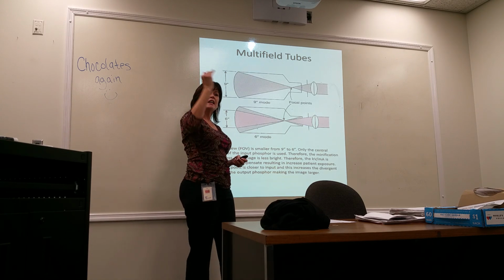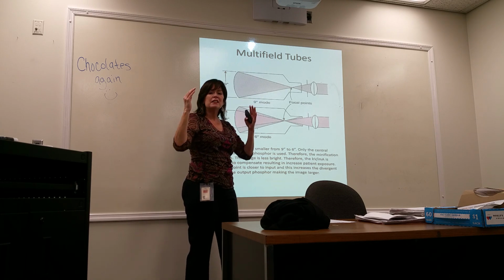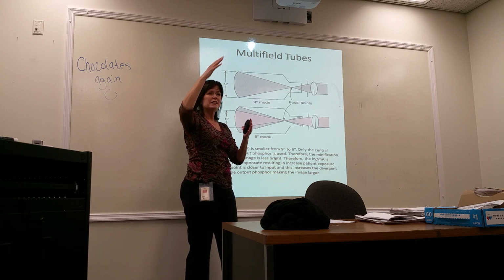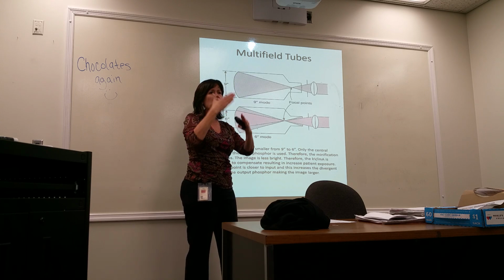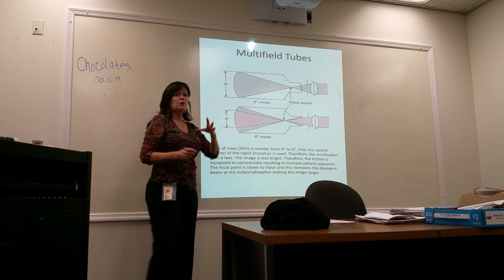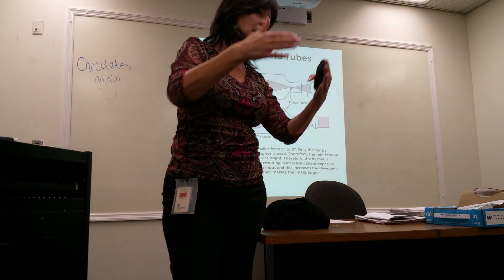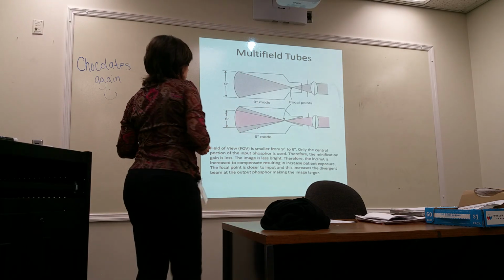So you know those electrostatic lenses that lead up to the anode in the II tube? In mag mode, that kV is like 25 kV plus, and so that increases, so it accelerates the electrons faster and they cross sooner. In normal mode, the electrostatic lenses are 25, then in mag mode it may go up to like 35, that sort of thing, and it makes them cross sooner.